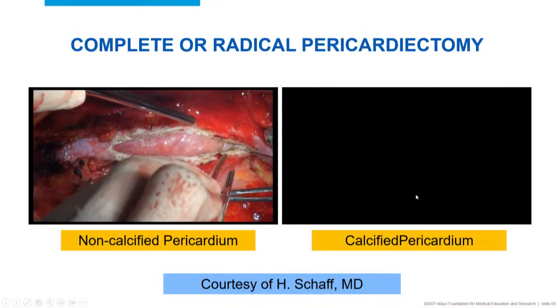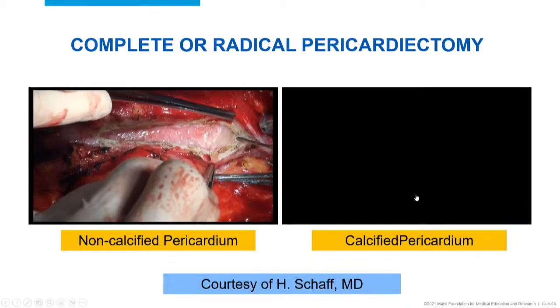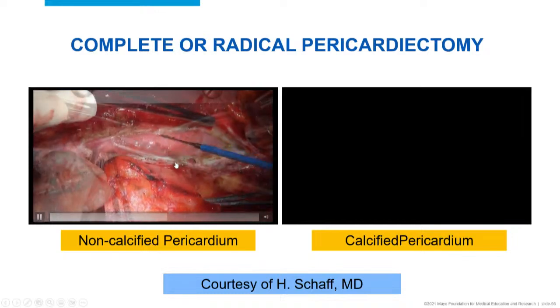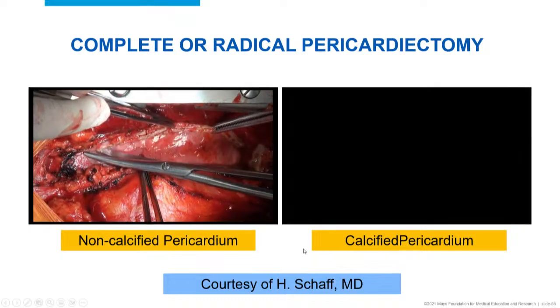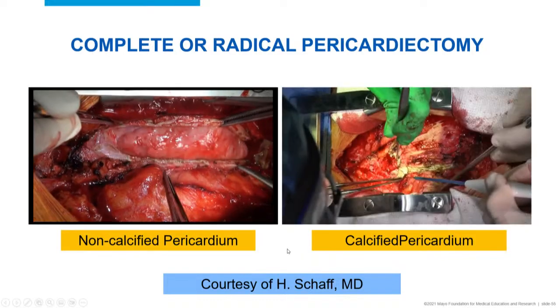So let me just show you this. Dr. Sheff, who is a master surgeon doing pericardiectomy, and this is a thick pericardial layer but not calcified. You can see that the heart tried to bulge. Okay, and then this is a calcified pericardium.